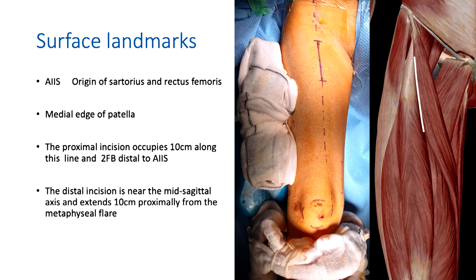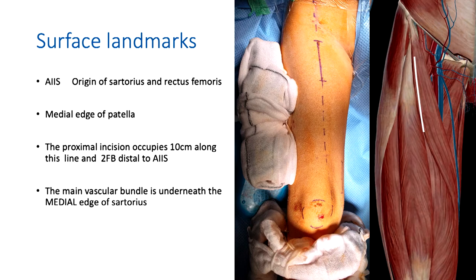Your second incision will be on the medial side of the femur over the femoral condyles. You can also use surface markings of two finger-breadths from the anterior inferior iliac spine. I've wrapped the fixator in a sterile swab soaked in alcoholic chlorhexidine, so that I can create at least an antiseptic feel for the fixator, and so that the operative field is kept away from the external fixator.